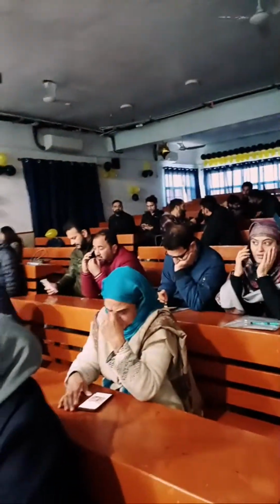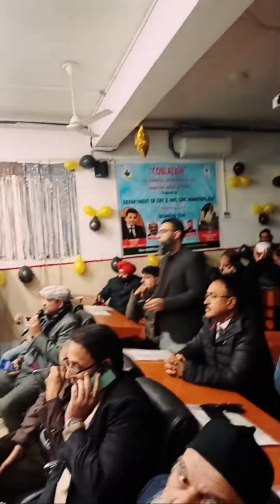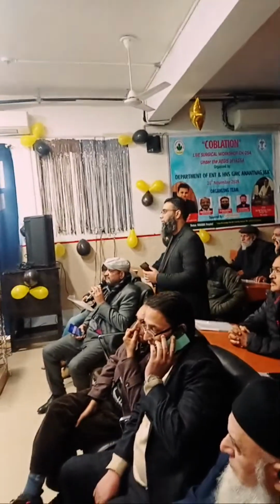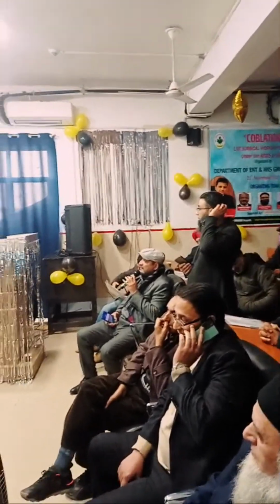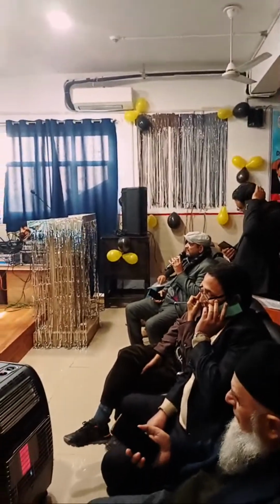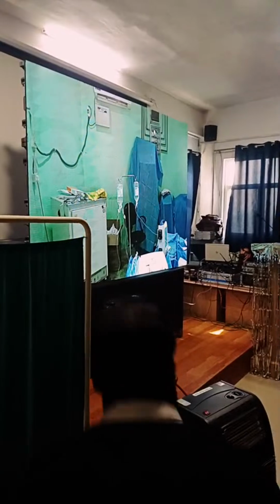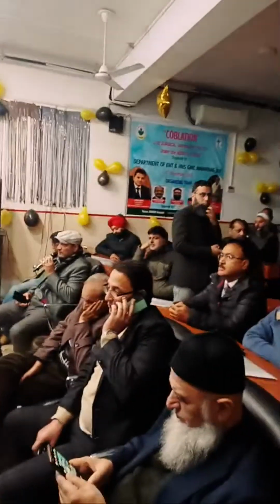Dr. Ankit. Yes sir. Table 2 hospitals. Okay sir. Can you machine service? Okay, sir. Dr. Ankit. There was a case present at table 2. Okay, sir. Camera is there at table 2 hospital, sorry. Okay sir.